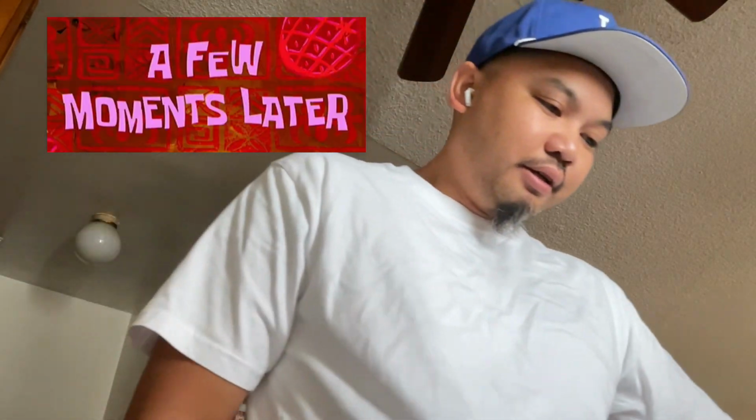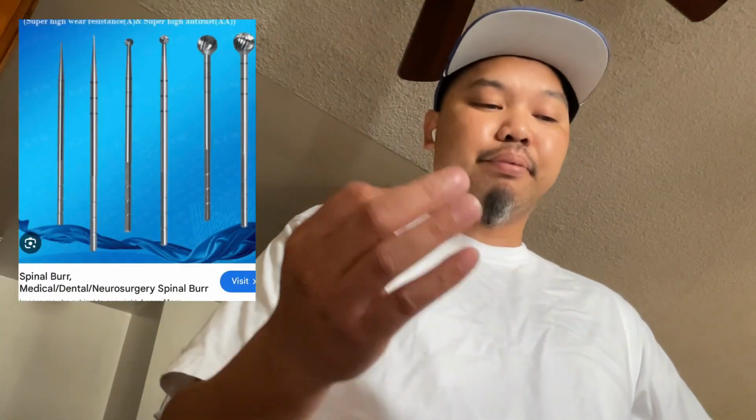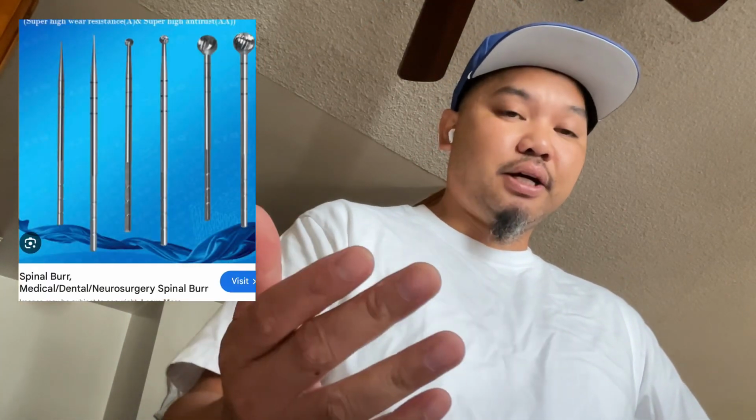Moving on. To clean the attachments that belong to the drill, usually they'll have different types of attachments for different types of drilling. You've got burrs, actual saws, blade-shaped saws, and so on. So those attachments that connect to the drill, if it's lumened, if you can see through it, a cannulated section, you basically just clean it with a brush, a pull-through, a rabbit's foot, and so on.